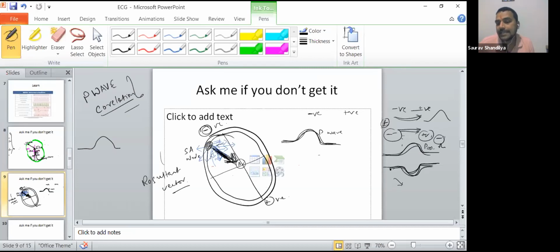Why? Because of course the current always flows like this, but if you measure from the opposite side, the graph paper will go opposite. It will definitely show down from the isoelectric line, but it still has a certain contraction value. It has reached the proper level, right? The action potential has definitely set in, but ECG is all about recording: which lead, and how you are recording. Thank you for understanding.